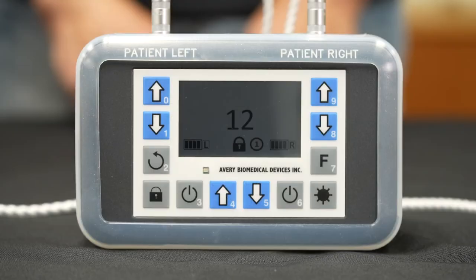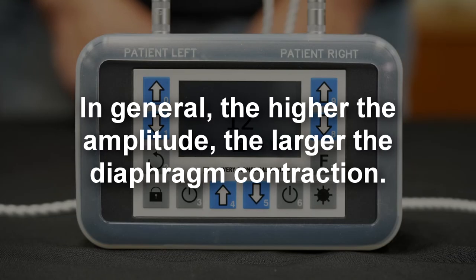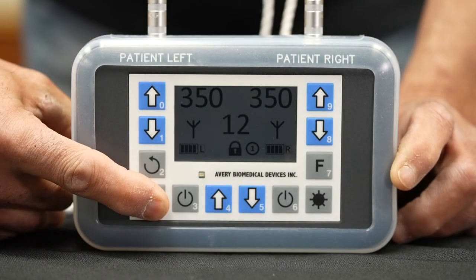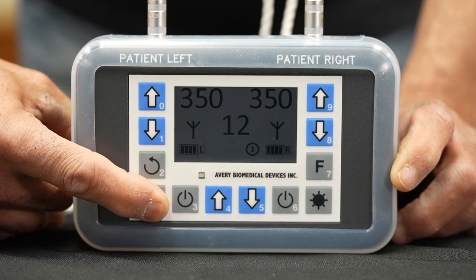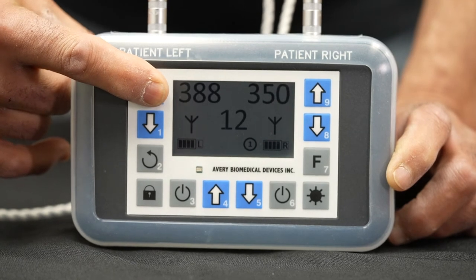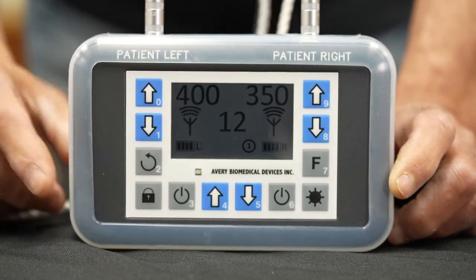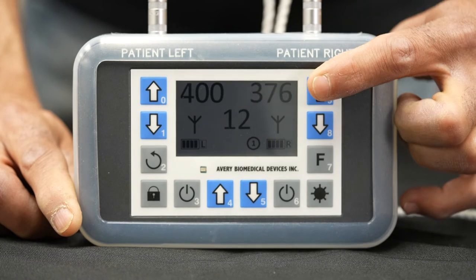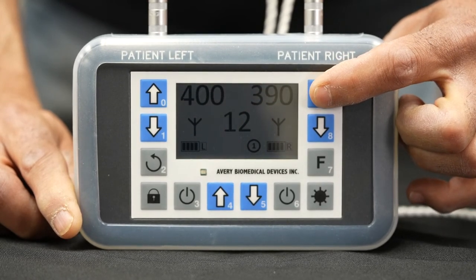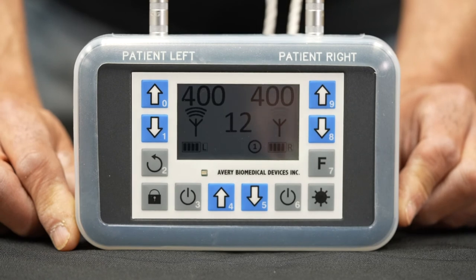Amplitude adjustment. After determining the threshold on the left and right sides, the optimal amplitudes need to be determined. In general, the higher the amplitude, the larger the diaphragm contraction. Turn on both sides of the Spirit. Starting at threshold amplitudes, gradually increase the amplitudes on the left and right side by pressing the up arrow keys until the patient achieves optimal tidal volume and diaphragm contraction without feeling discomfort. If the patient feels discomfort, lower the amplitudes while still maintaining optimal diaphragm contraction and tidal volume. If this cannot be achieved, call Avery customer service.